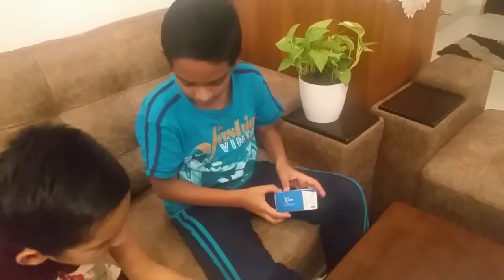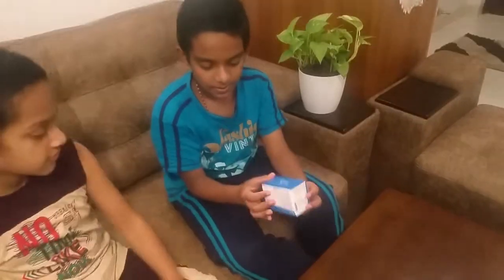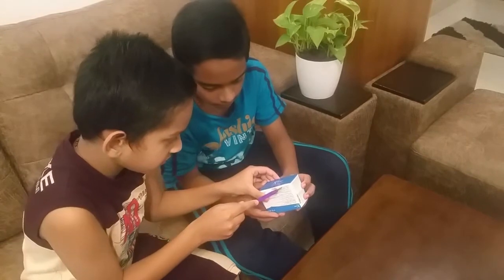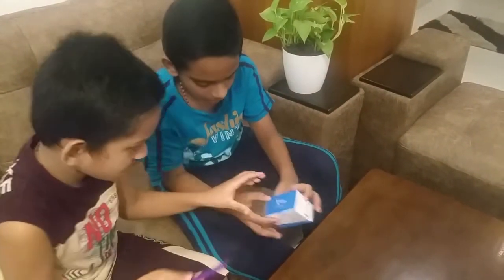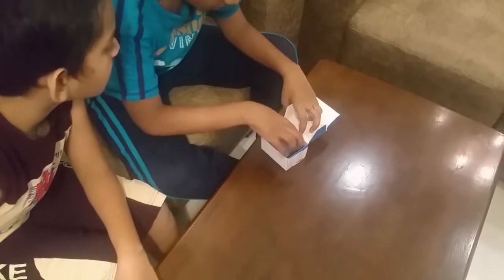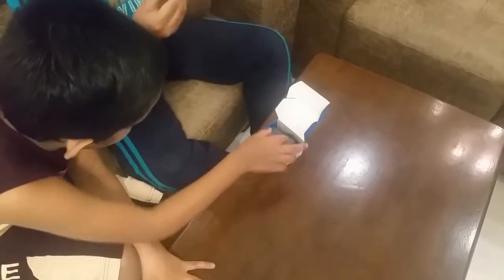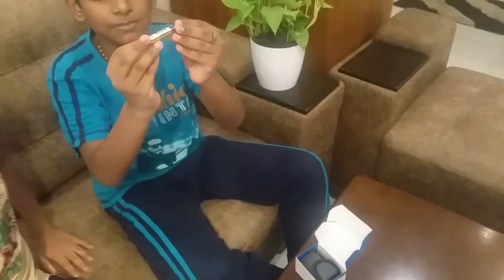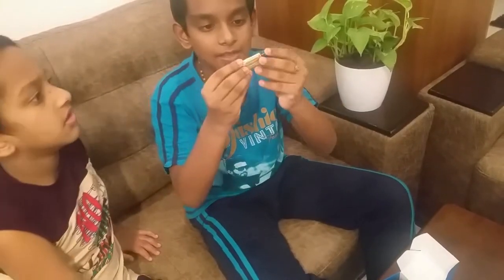We have a seal here, so we always have to open it when there's a seal. Now where's the knife? Oh yeah, open it. Thanks a lot. Oh wow, guys!